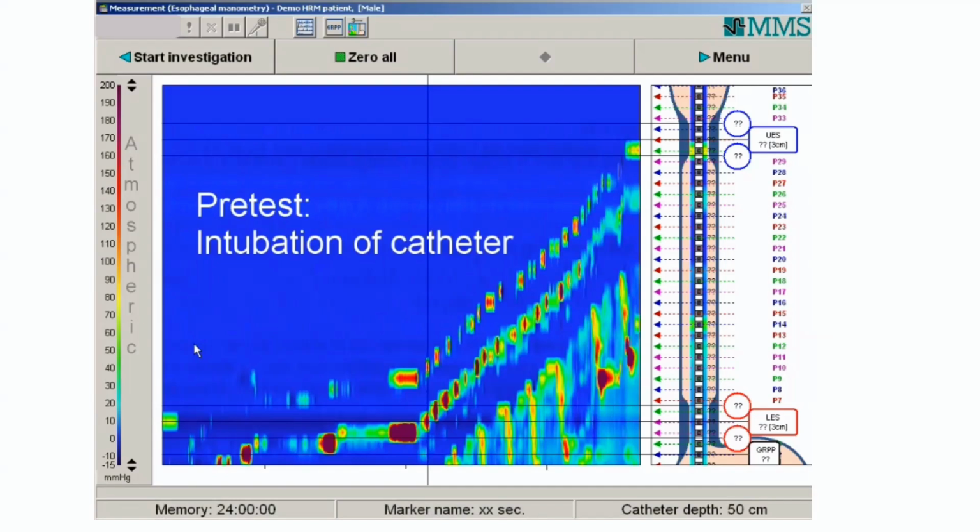I can do this, but if I notice big changes in the readings, in the value for the DCI or the IRP, I shouldn't rely on this interpretation. But if it's totally normal and deactivating the sensor did not affect the results, it will be okay. But if I am borderline and deactivating this sensor will change the result, then I have to make sure that this catheter is working on all the sensors.